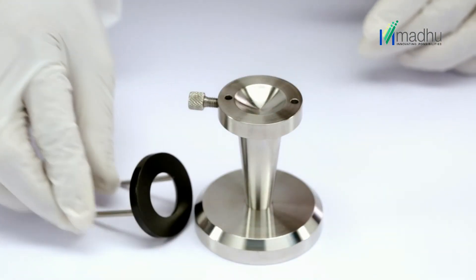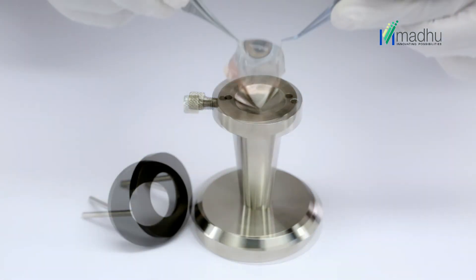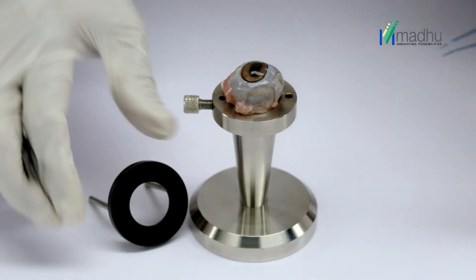Open the top fixation ring and put it on a side. Place the animal eye in the central cavity of the conical stand.